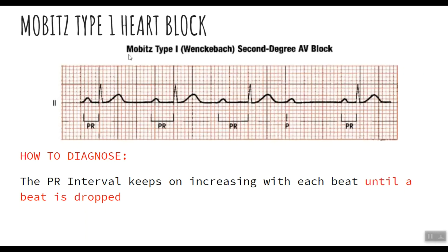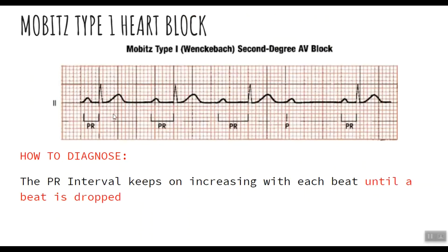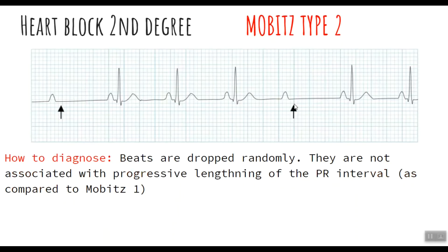In Mobitz type 2, the beats are dropped randomly — any beat can be dropped and the dropped beats are not preceded by progressive lengthening of the PR interval, unlike Mobitz type 1 where the PR interval kept prolonging until a beat was dropped. In Mobitz type 2, the PR interval remains constant and then suddenly, out of nowhere, there is a dropped beat.